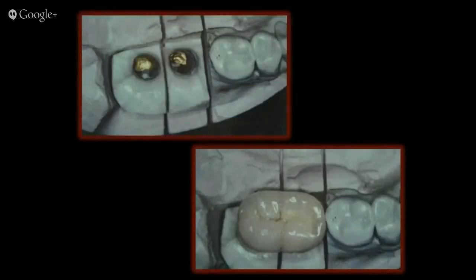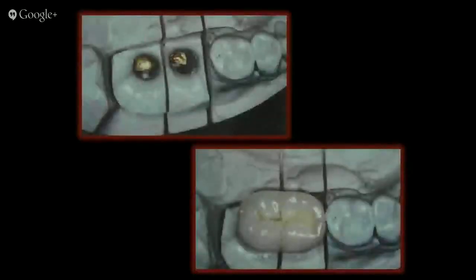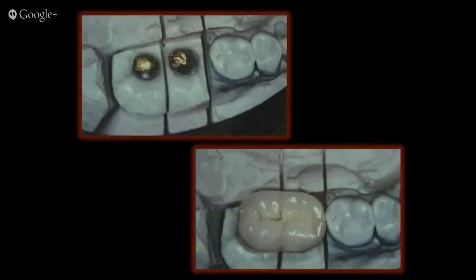Is it possible? Yes, very much possible. My lab technician will make a huge crown such that I get good class 1 relation. But then what I am also forgetting is, after fabrication of such a huge crown, there is the placement of the crown which is going to be at an angle to my abutment. My abutment also will be placed at an angle to the underlying implant.